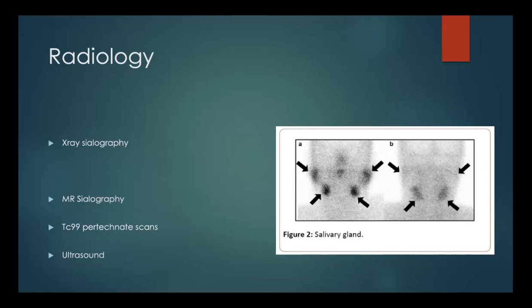Now, this is an image of a pertechnetate scan. And this is really, really a salivary gland function tool, wherein the intensity of your uptake tells you just how much the gland is functioning, and this will have a really important effect on my talk later, and it influences all our results. This is not something that we usually do. We reserve it for basically our failures, but yes, I want you to just remember this image.